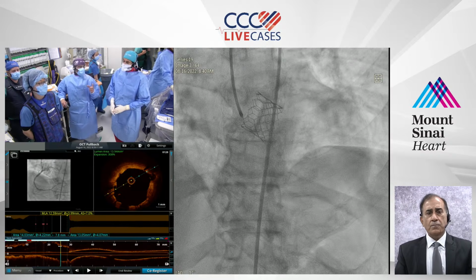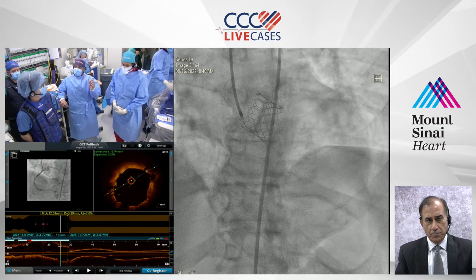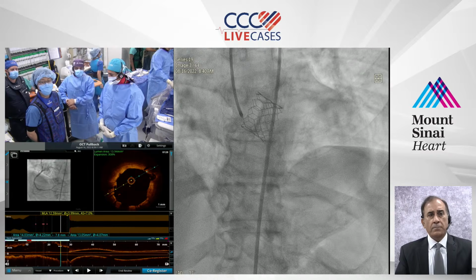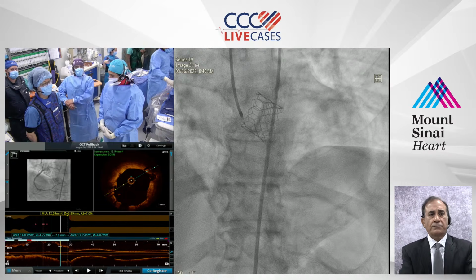On the left side, people have brought the guide liner and injected saline through the guide liner, so there is a very small area of blood-free vessel and you have a good picture even with the saline. So that's what we need to see. We'll do some practice runs, and maybe we'll update our audience.